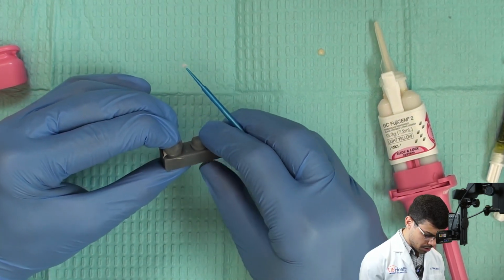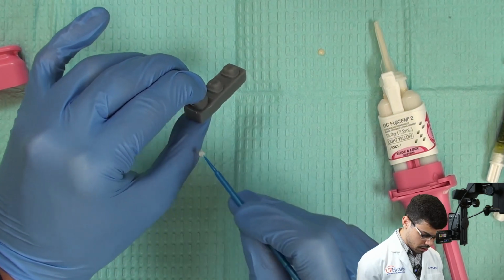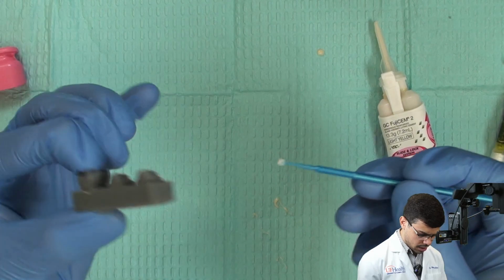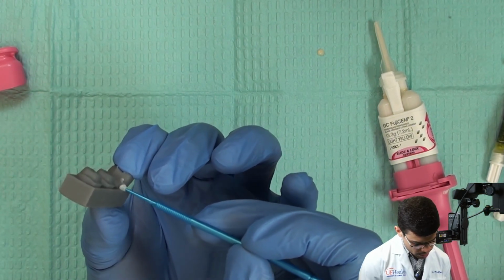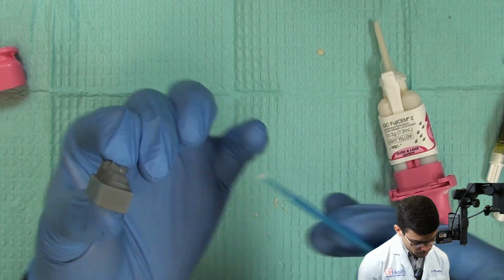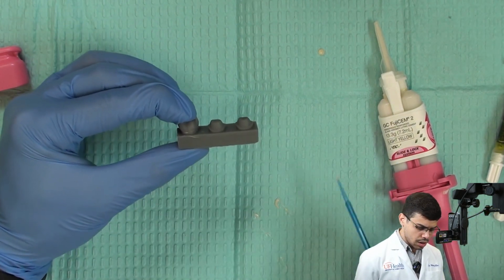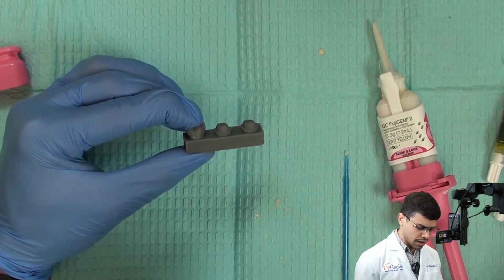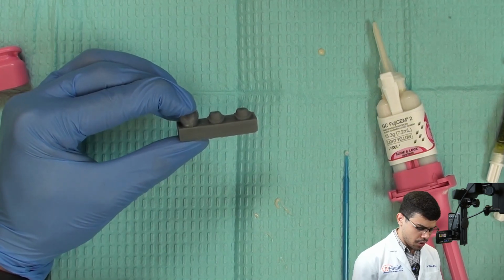And then what I'm gonna do is, I'm gonna make sure that I'm not moving that crown, okay? For the first 2 minutes. Because the thing is, you have to ask your patient to go ahead and maintain the bite. So put a cotton roll and ask the patient to bite on it. And then you're gonna keep that. But the first moment, you have to press that crown and stay with that.